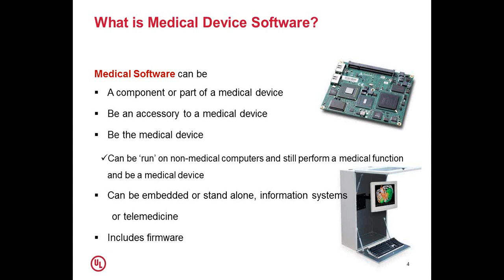For example, if you look at a workstation and an X-ray machine or a console of an MRI machine, the workstation employs certain software where the diagnosis happens and control happens for the medical device, that is the MRI. It can also be embedded or a standalone information system, and it will also include firmware.